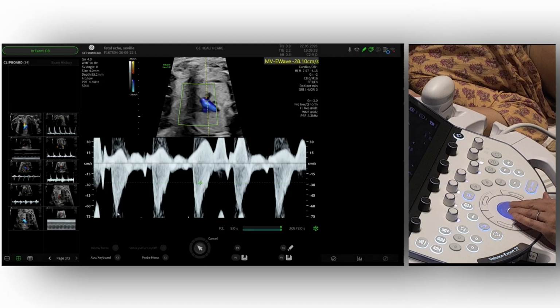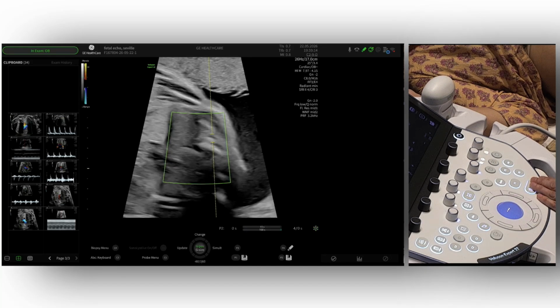Here in negative, we have the aorta, and in positive, I'm getting the innominate vein, which again has this notch. So the innominate vein has a reverse flow, like when we have a reverse ductus venosus, reflecting the atrial contraction. Again, we have the atrial contraction and the ventricular contraction: atrial contraction, ventricular contraction, atrial contraction, ventricular contraction, yeah?